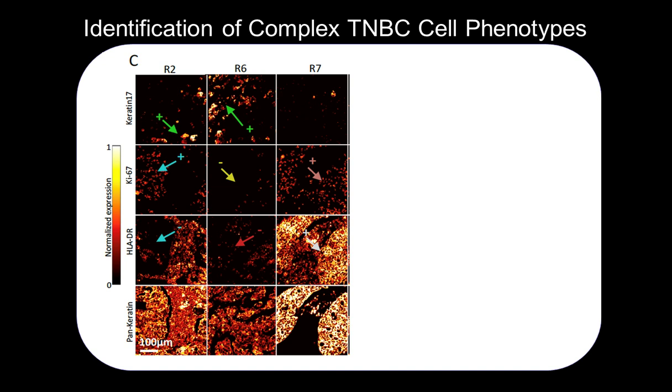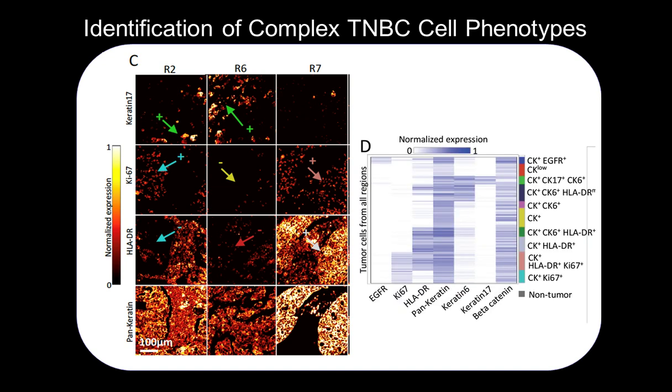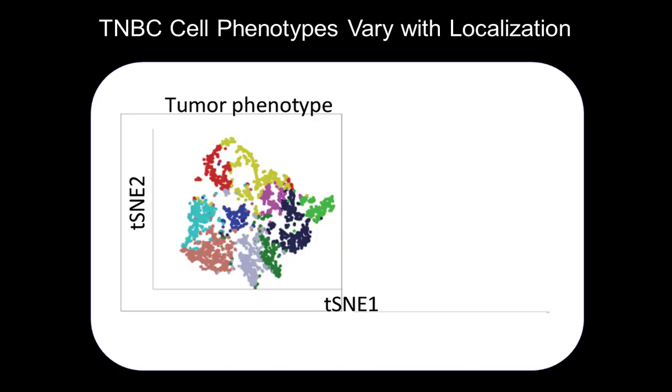And so just focusing on the tumor cells to start here, what we see is even within a couple of these sampled areas, you see changes in gradients of tumor markers like keratin, changes in proliferation, changes in abnormal expression of immune markers like class 2. And so there is a strong suggestion of heterogeneity. And when we extract the tumor cells from the image using our segmentation pipeline, we can cluster the extracted features. And within a single tumor, we can assign multiple tumor cell subtypes. And so then the question is how do these subtypes vary across regions of the tumor?